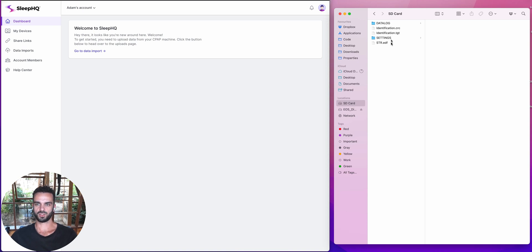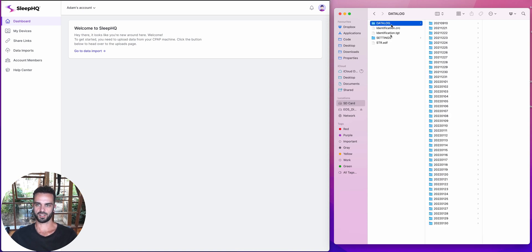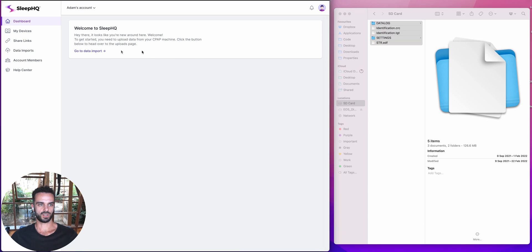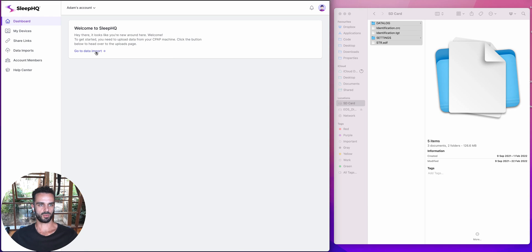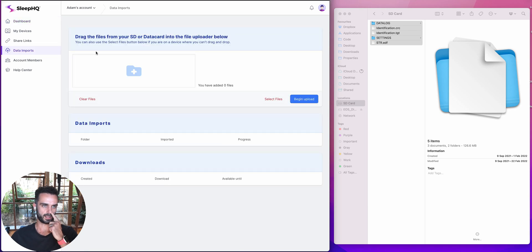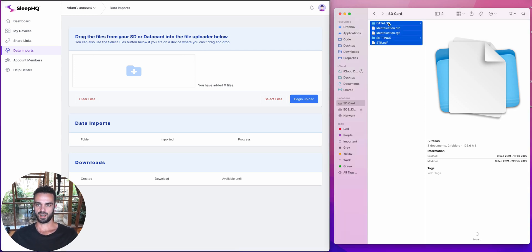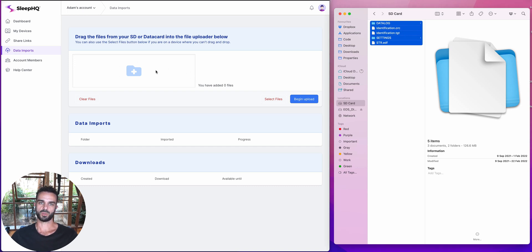That's my SD card. And these are all of the files that sit on my SD card in there. So first step, when I log into my Sleep HQ account, I've got this little message that says that I'm new and to go to data imports to get started. So I'm going to do that and click on the data imports. Now, the easiest way to do this and the way that's going to work for most people is just to select everything that's on your SD card like I've done here and drag it straight across into this file upload section.